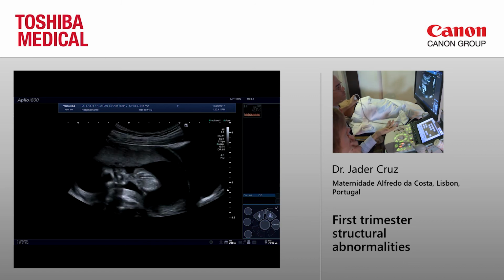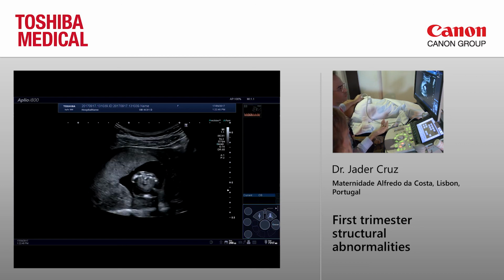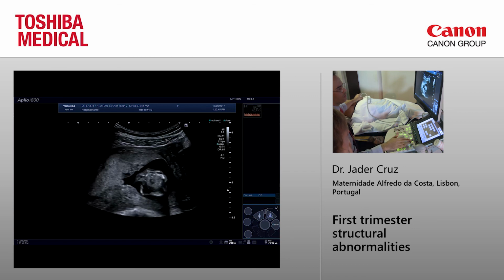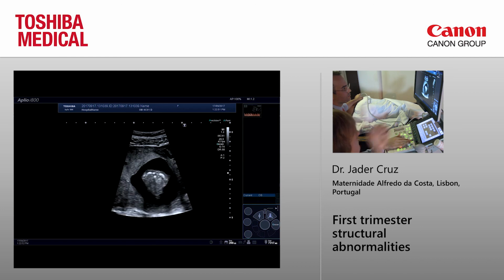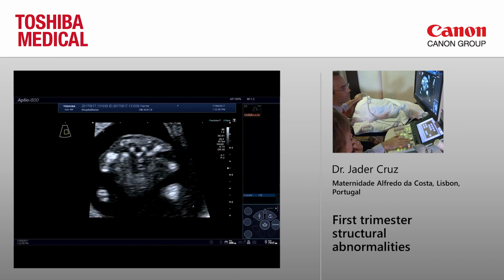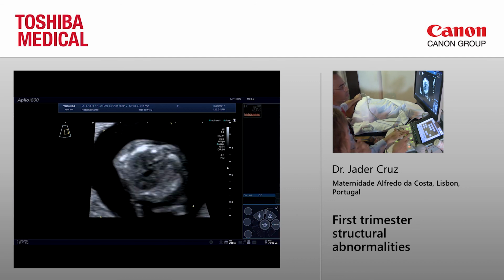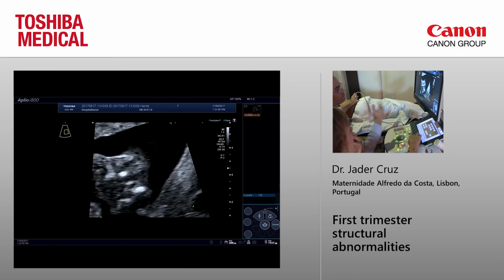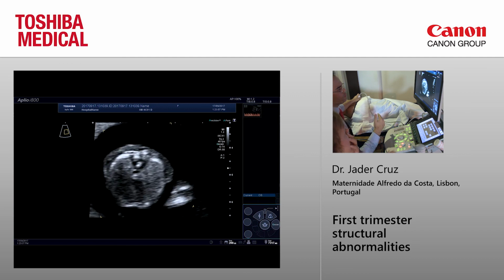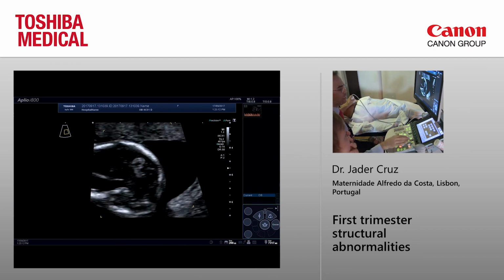Nowadays for trisomies, you measure that. Tricuspid, I hope I can show you, the heart there. You can also do as you do with the ductus venosus, either from the front, from the apical view, or from the back. You need the baby to be still to measure that, not the case.